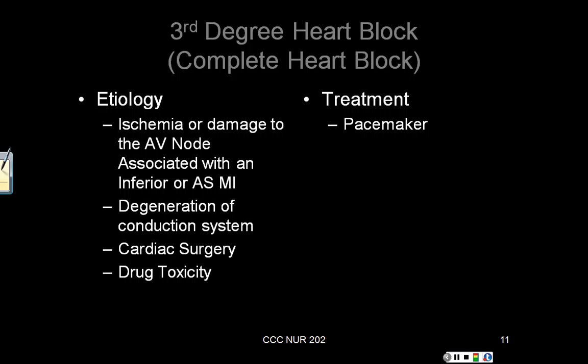As we get older, things begin to deteriorate. Cardiac surgery is typically one of the big things. We'll see this with cardiac surgery, especially our bypass graft patients and with our valve patients. Many times we plan ahead for this by actually putting in something called epicardial pacing wires. And Ms. Lee will talk a little more about that as she talks about coronary artery bypass graft.